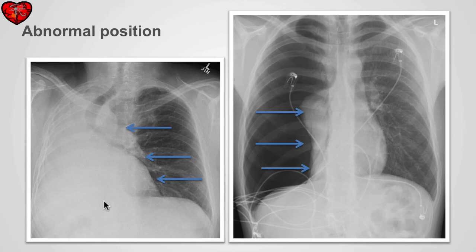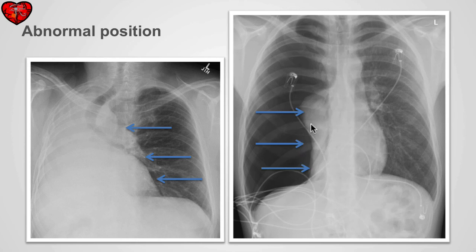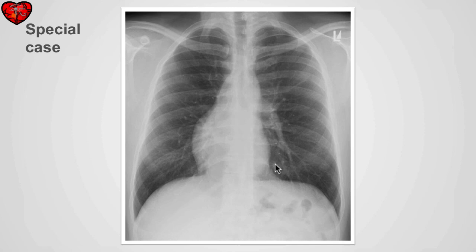In these cases, we have abnormal position of the heart. In one case, the abnormal position is caused by a previous pneumonectomy and displacement of mediastinal structures to the side of the surgery. In another case, a tension pneumothorax with collapse of the entire right lung causes a shift of the mediastinal structures including the heart to the left. We also see a case of complete reversal of the cardiac shadow, called dextrocardia.